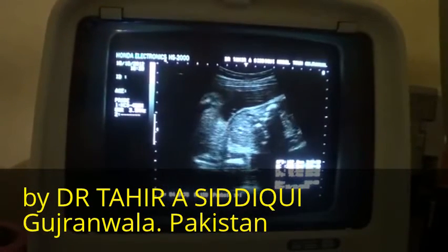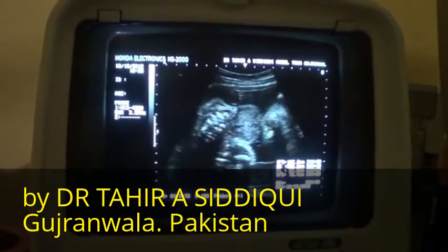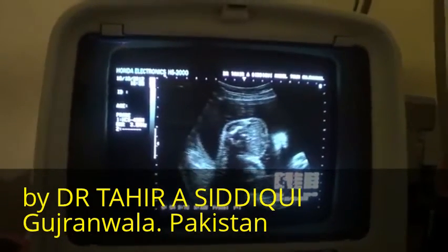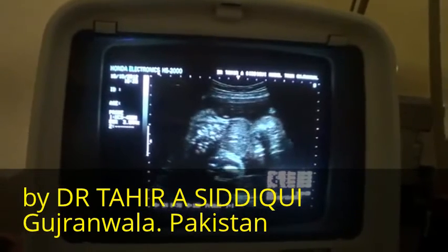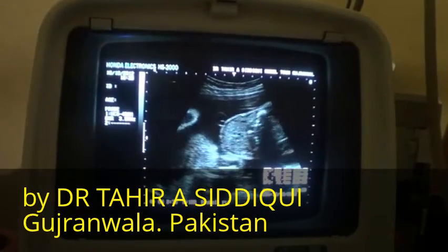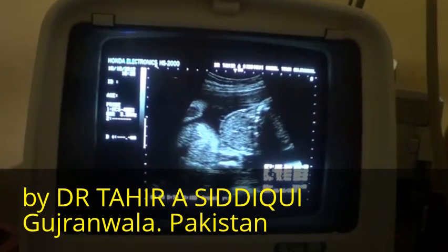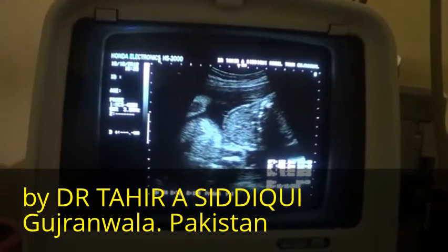It rolls out. It's not evenly echogenic as we are seeing this area to be, and it has a covering around it. Its covering suggests that this area, this is the head, this is the brain.